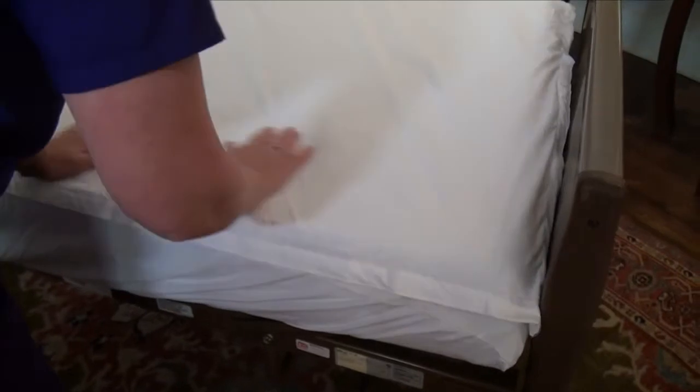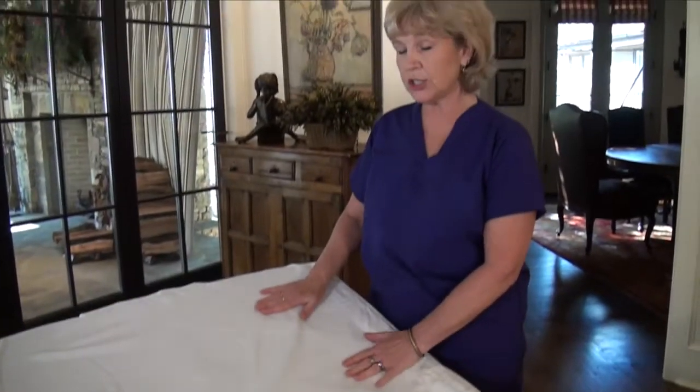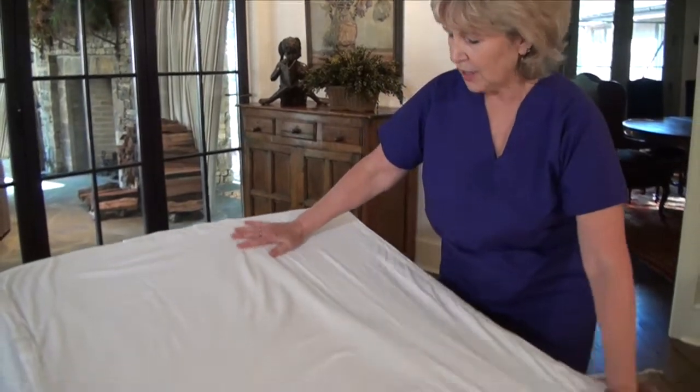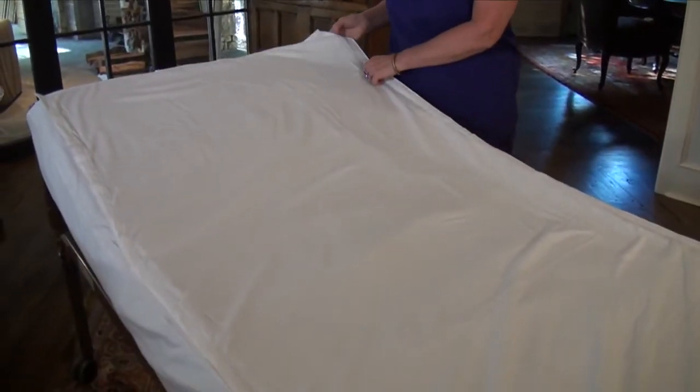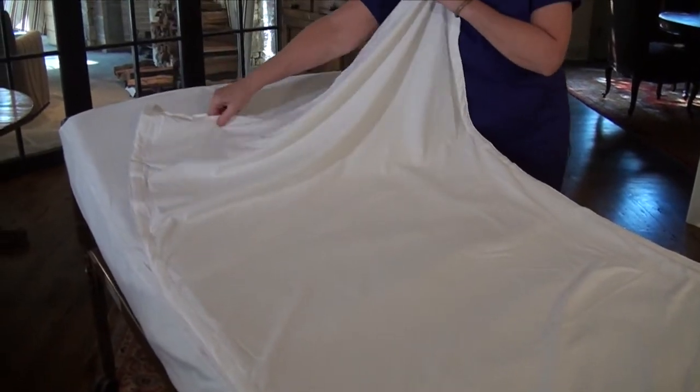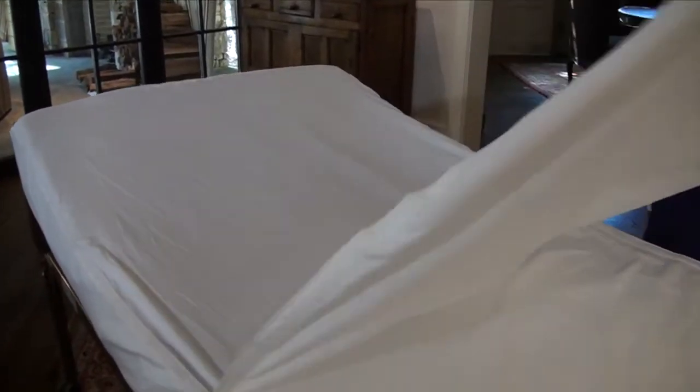There are a couple more points I'd like to make. First of all, our patient lays on top of this strip sheet. It's nice and smooth, and when this gets soiled or it's time to refresh it, you simply grab it from the top or from the sides, pull it down, and replace it with a new one.